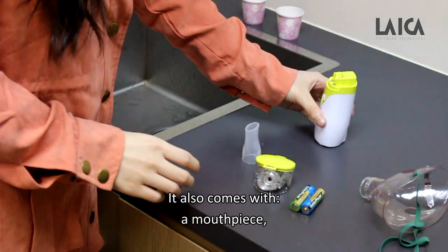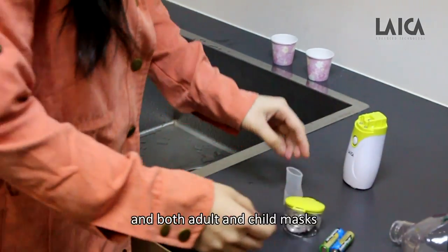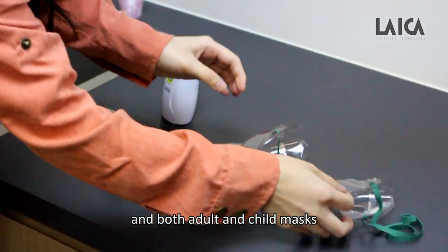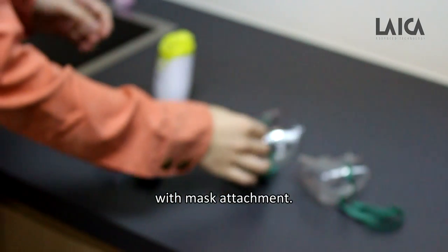It also comes with a mouthpiece, both adult and child masks with mouth attachment.